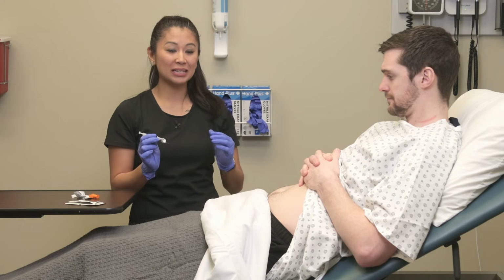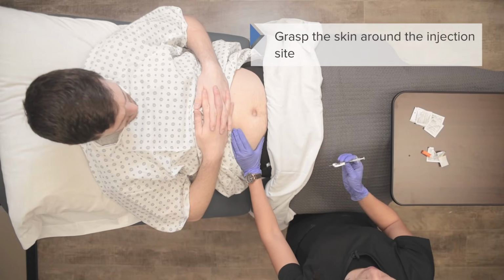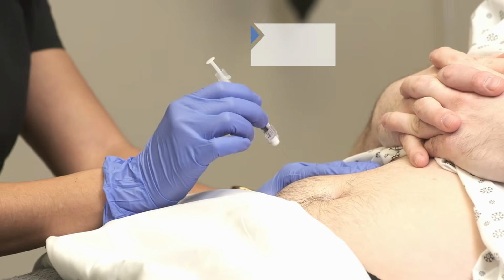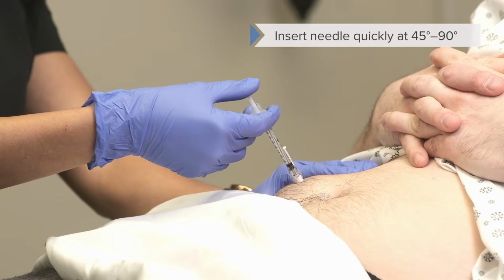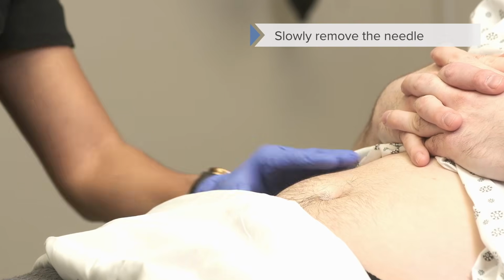All right, so now I'm going to take my non-dominant hand. I'm going to plump up the skin or the site just to give me a landmark and also make it a little bit more comfortable for my patient, and go and inject. All right, I'm going to go ahead and give your insulin, sir. So notice I darted. Then I'm going to inject my medication, and now I'm going to slowly remove it, and then I can release the skin.